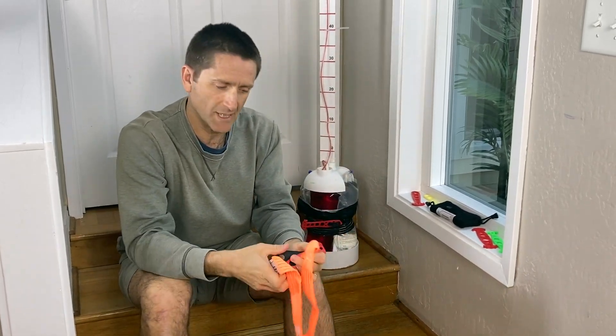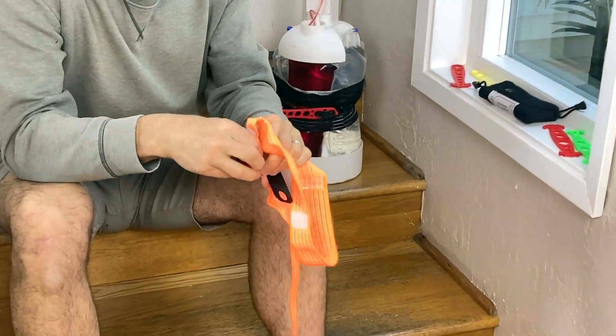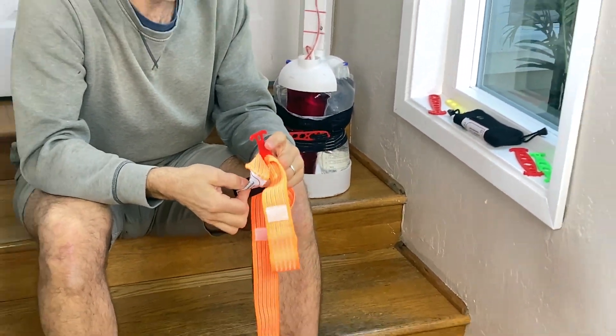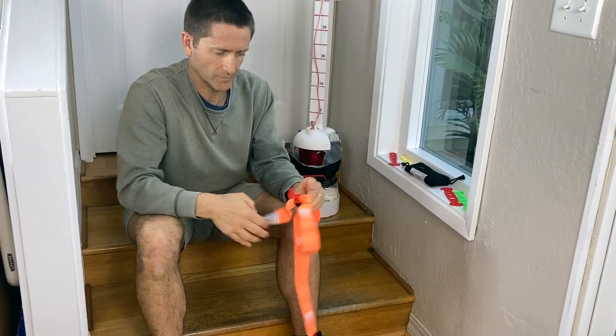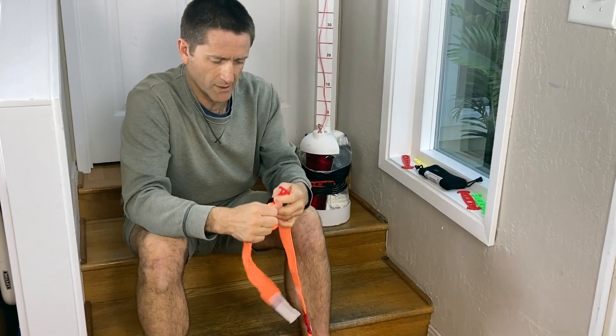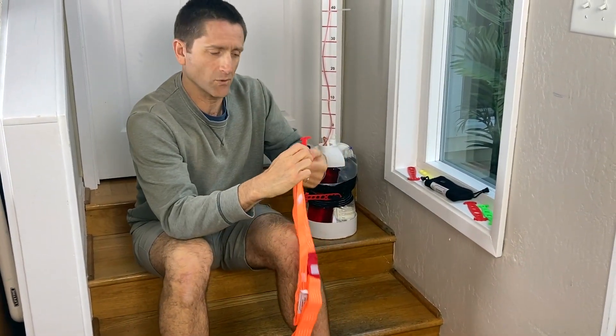Once again I'm doing the same thing — I'm going to put the label through one hole and then another hole, and then pull all these through until it's nice and flush. There's a little bit of room to adjust it here.